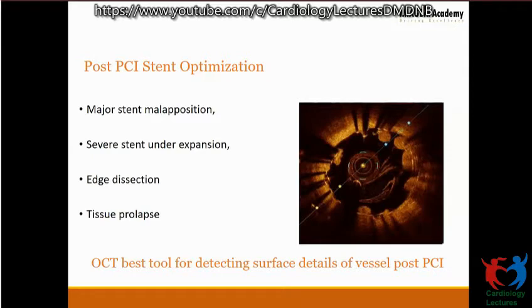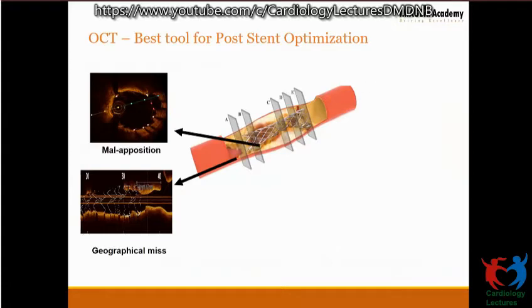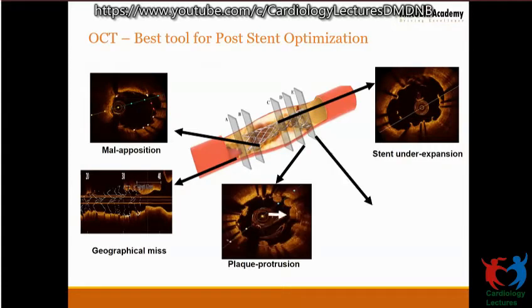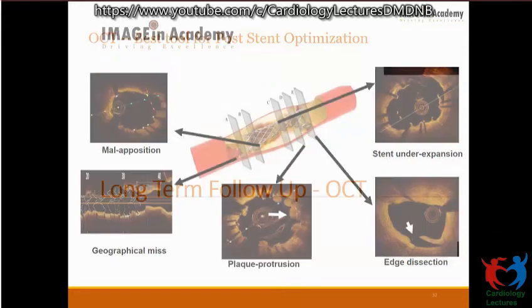So if I had to have one tool which picks up all of this, it would be OCT, which is much more sensitive than angiography or IVUS. The surface detail which OCT provides is absolutely unmatched, and it really tells you whether you have gone wrong while optimizing your stent, or whether you need anything more to ensure event-free survival post-angioplasty. One can detect geographical miss, malapposition, under-expansion, tissue prolapse, as well as edge dissection. All these are things we pick up post-stenting and need to assess while doing different runs, to make sure you don't have any of these, which become the nidus for stent failure in a short span of time.